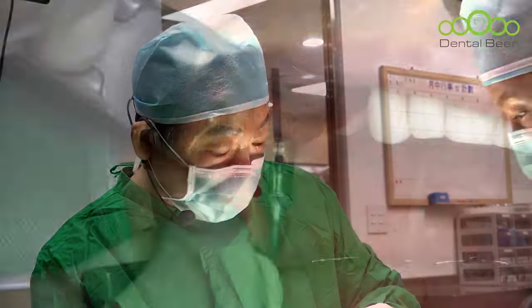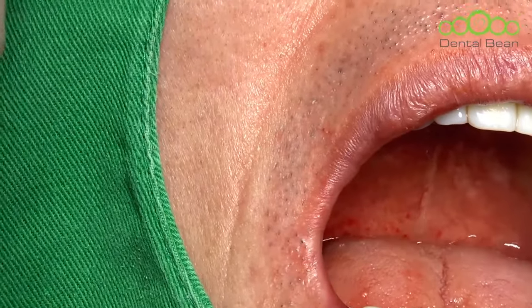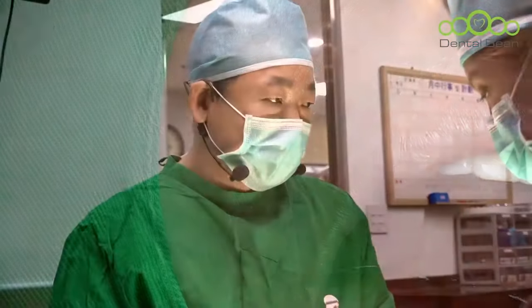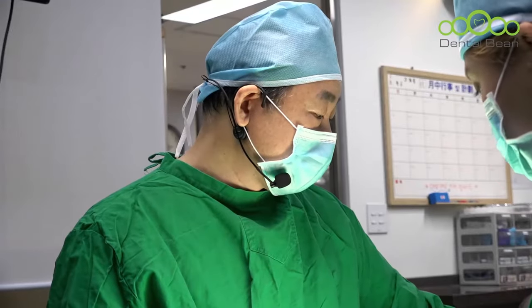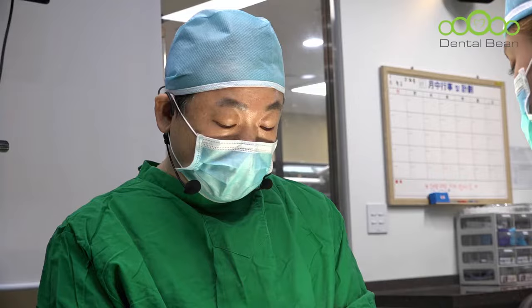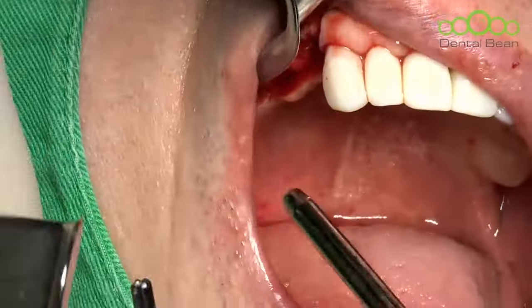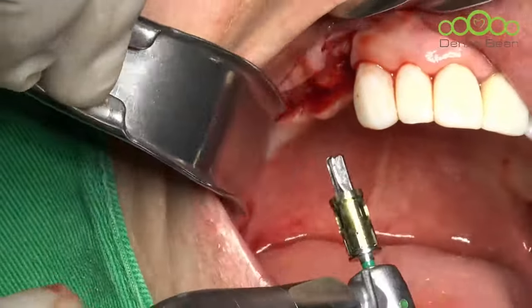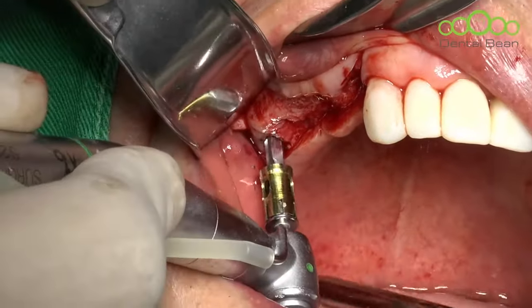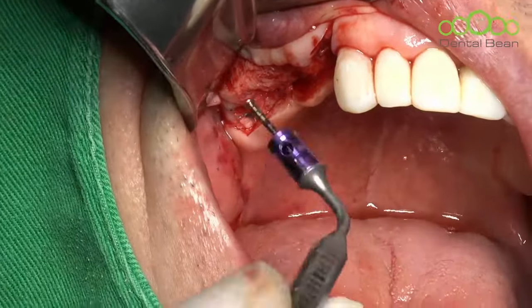Okay. Not yet. Bone is very soft. In non-soft bone, the final drill to place a 4.5 implant is 3.3. However, sometimes I even reduce the size. One more step means that it is a 3.1 cast drill for a 4.5 implant. And then this is a 7 millimeter stopper. Okay, check with an 8 millimeter stopper.